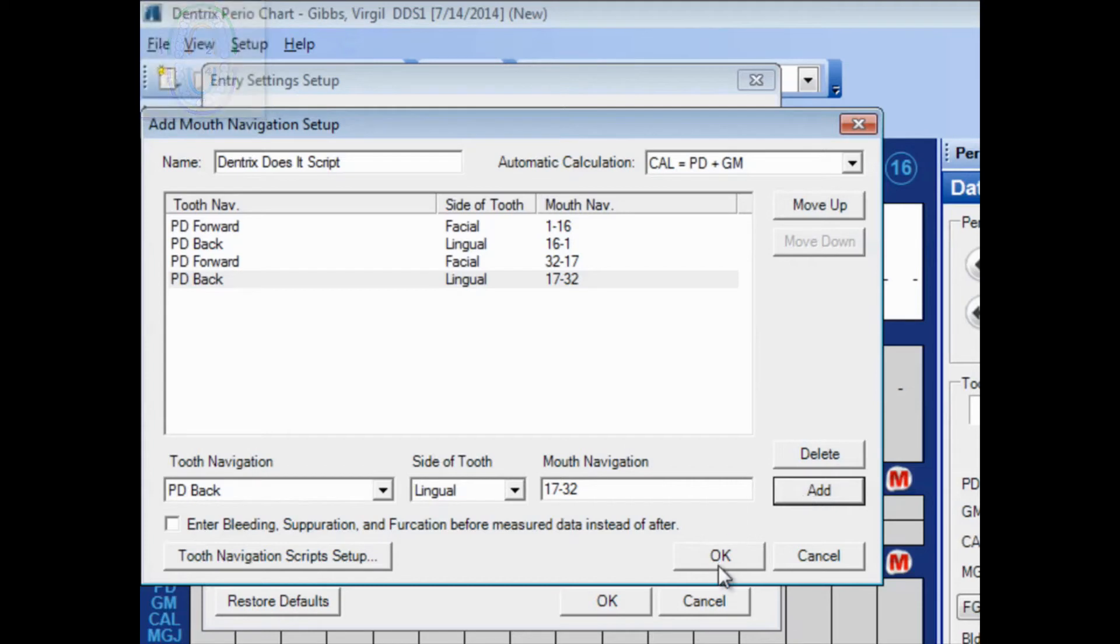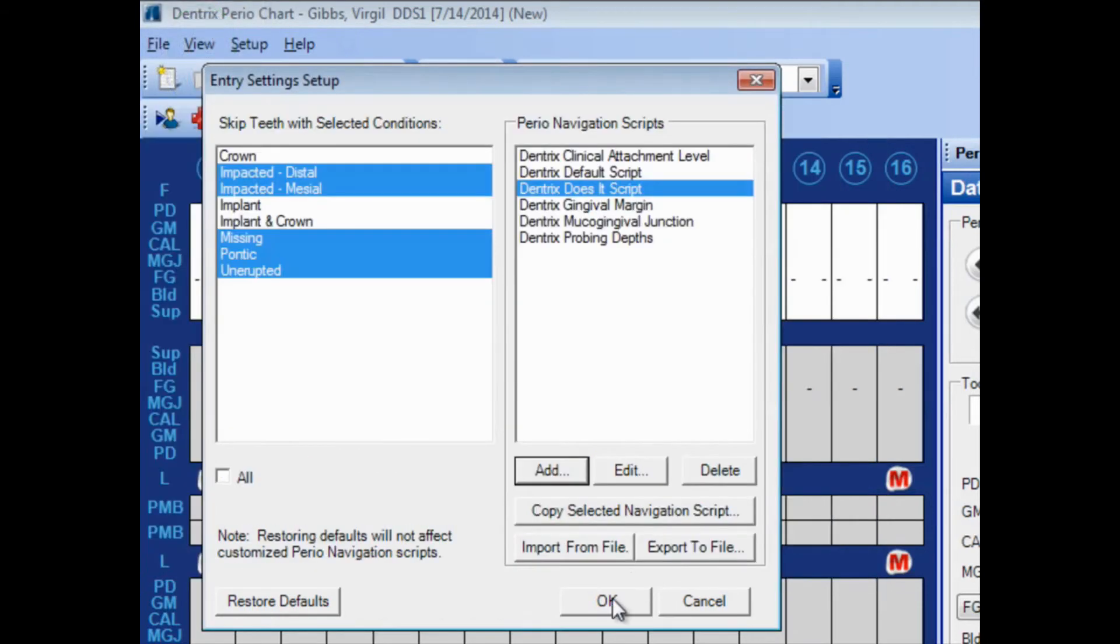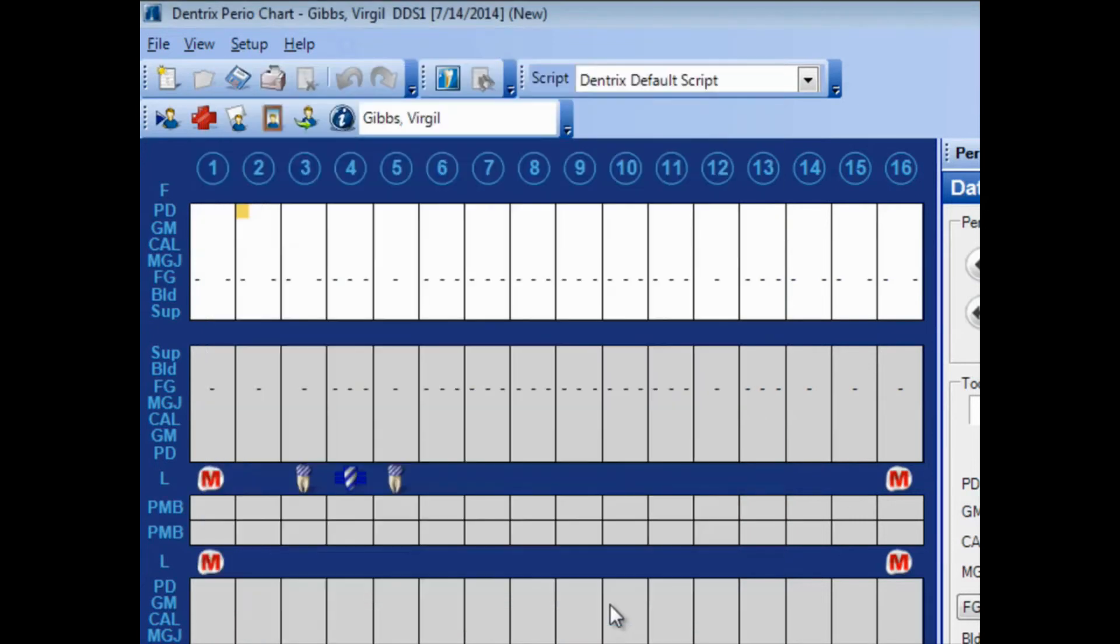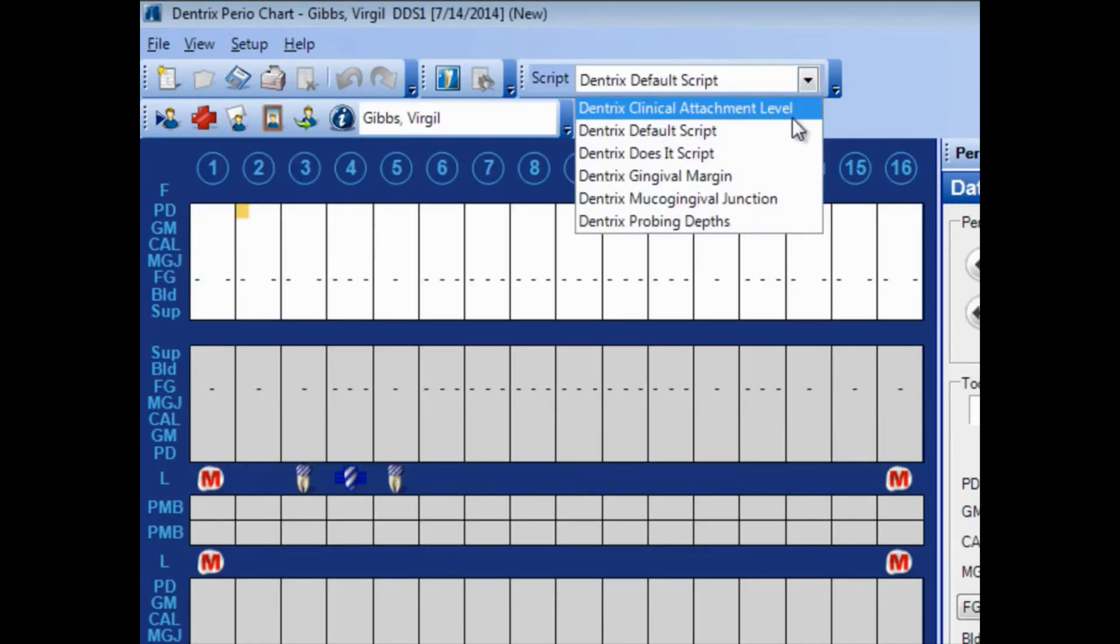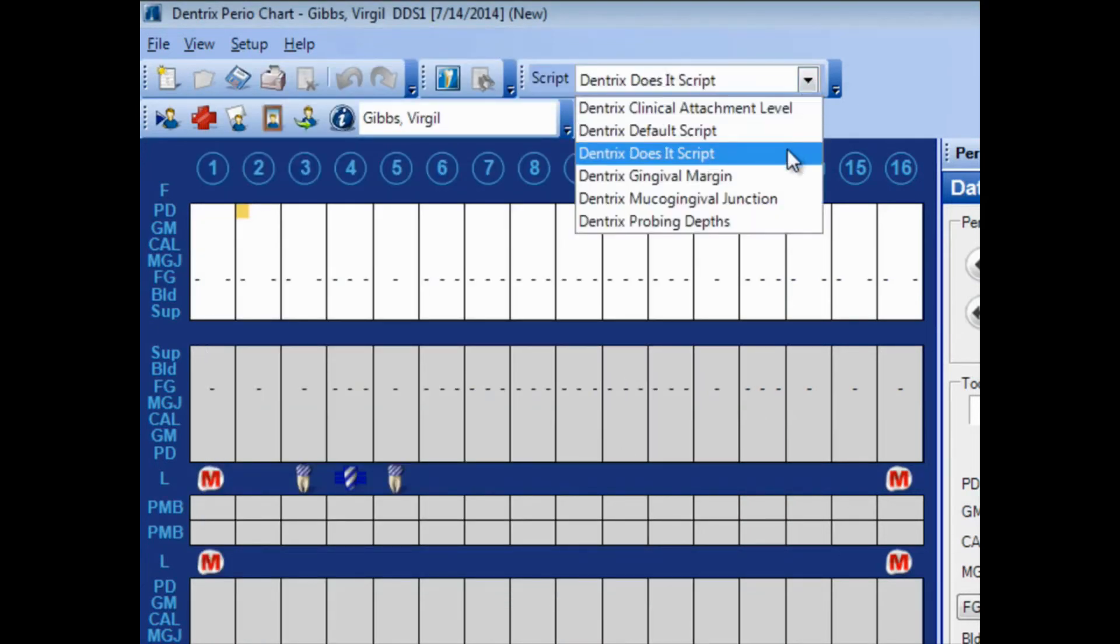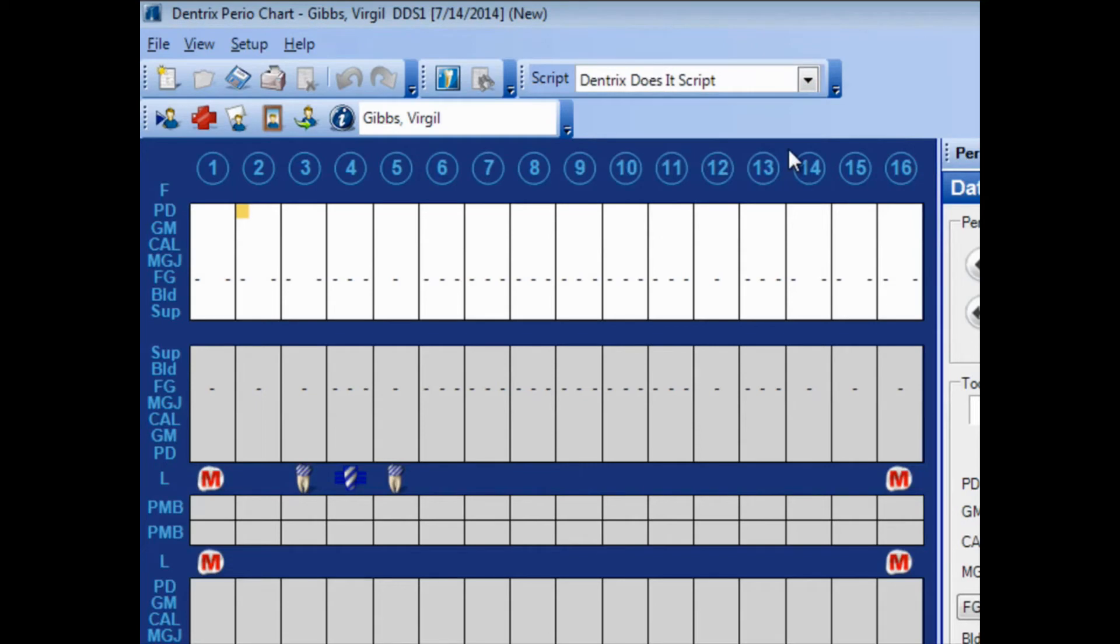Now I'll click OK. My script is part of this. Click OK. I could now pull this menu down, choose the script, and this station will remember that script until I change it again.